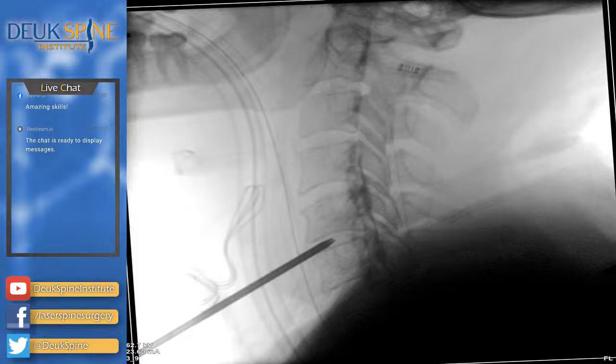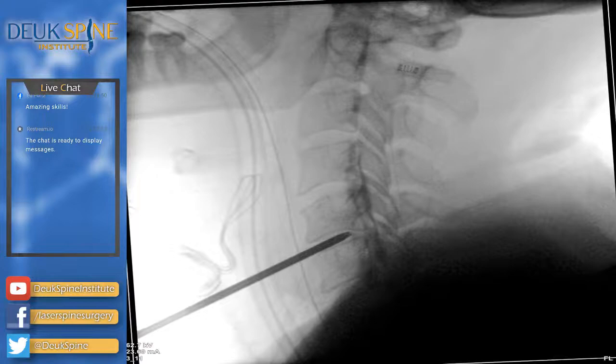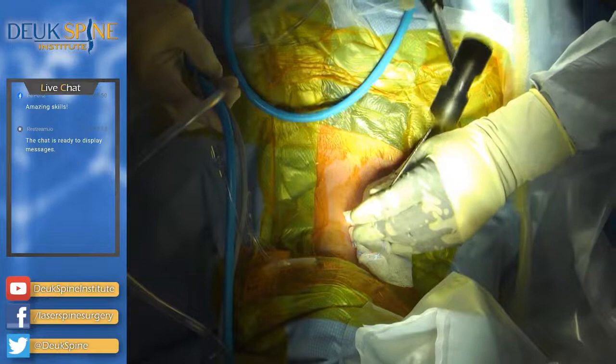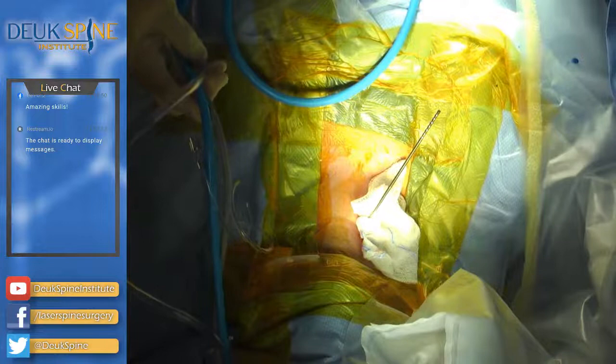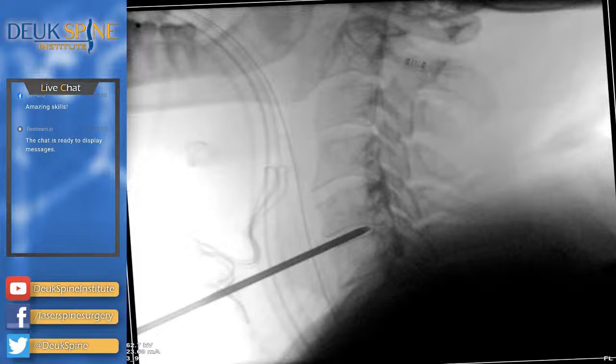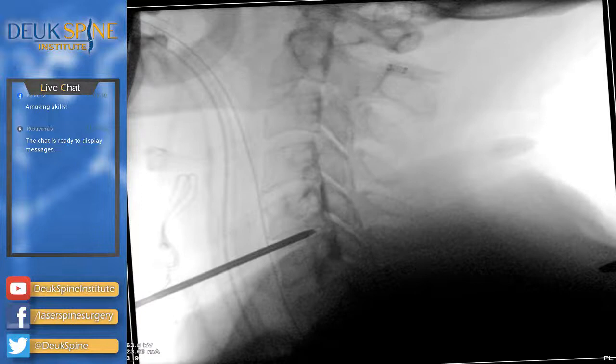Now our patient, and by the way, your orbit is off. I don't know if you can see that. The back of the bone is double. You see it? I think my side's too low, if you have to ask me. My side's too low, but go ahead. Didn't fix it. You gotta raise my side, I believe. I don't know, whatever you did looks worse. What do you think? That is, I think, better. Right? Yeah. That looks better.